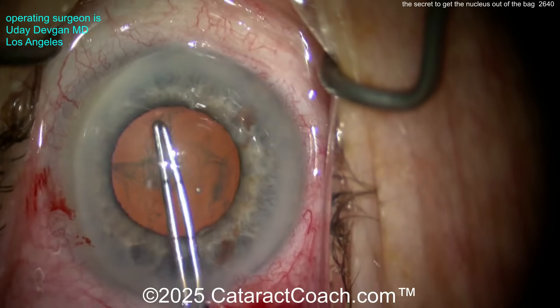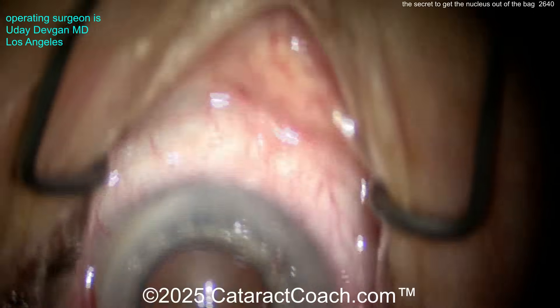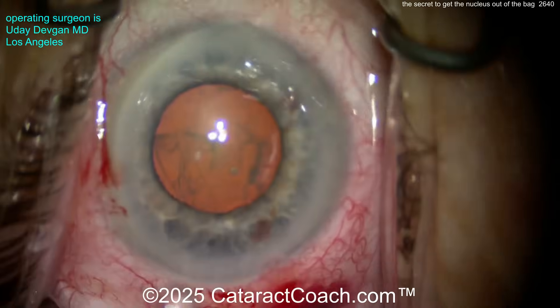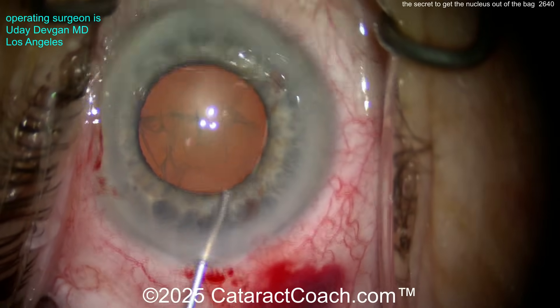Because if you have a baby rhexis — a four millimeter, four and a half millimeter rhexis — and you try to prolapse the nucleus out of the bag with hydrodissection, it causes too much interlenticular pressure. You could even blow the posterior capsule. So you need to have a nice, generous, big rhexis.